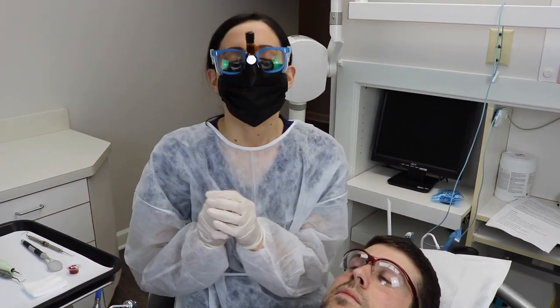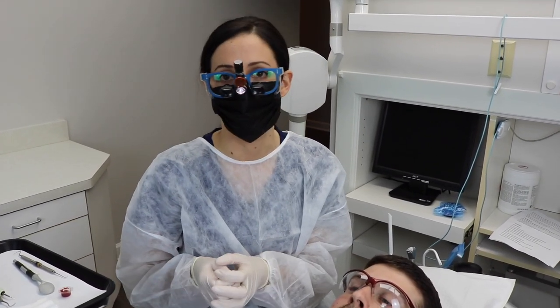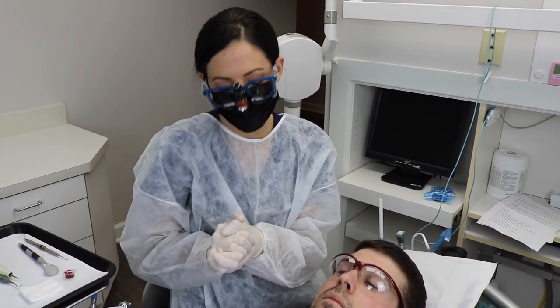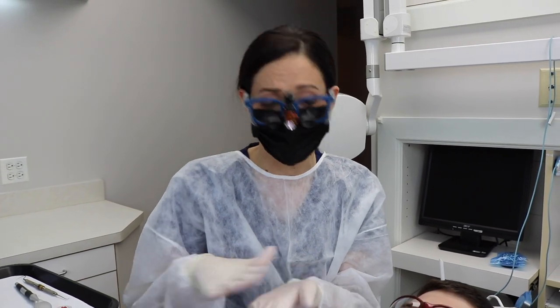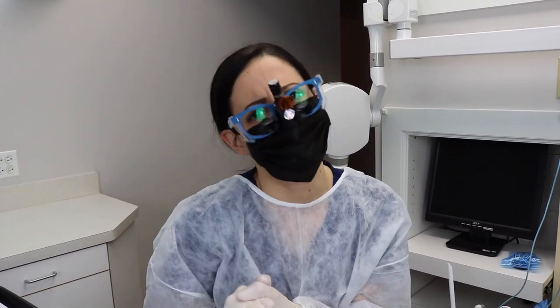If it does spray the patient, just think of good phrases to make them feel comfortable. Like if you spray them with water, be like, 'Oops, sorry — I'm giving you a face wash today!' Just do the best you can. Sometimes it's messy — this isn't the spa. I like to always joke it's not quite a spa; we're making sure medically we're cleaning the teeth properly and then polishing at the end to make the teeth smooth so plaque is less likely to adhere.